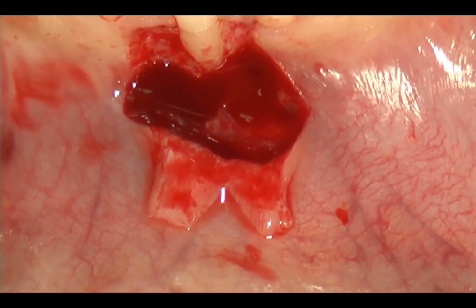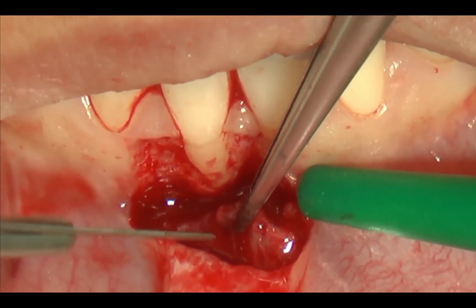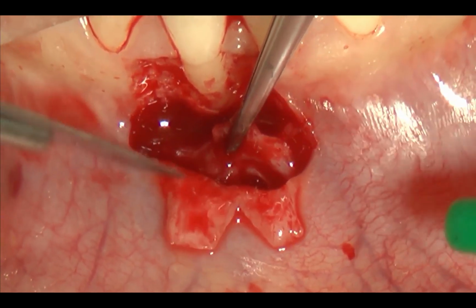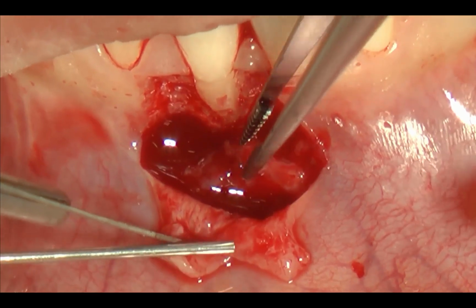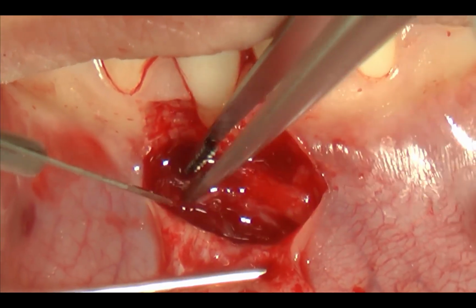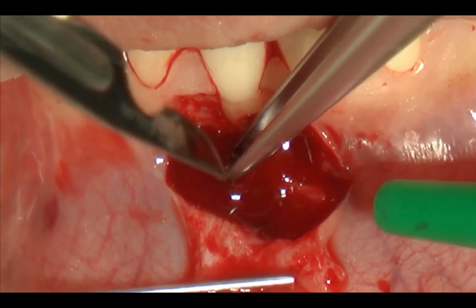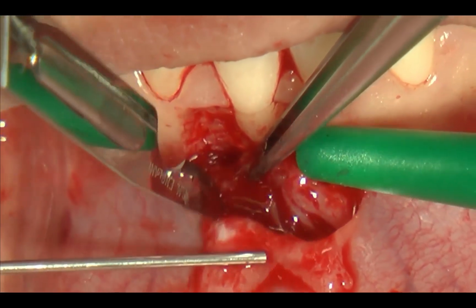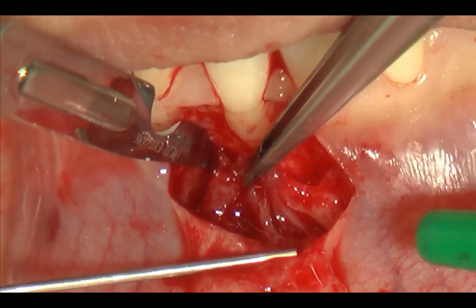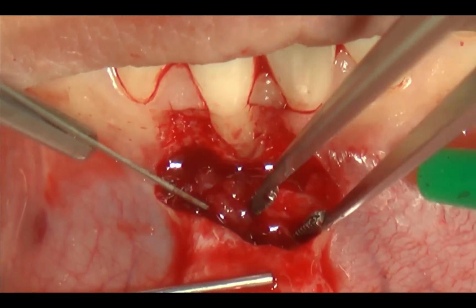So there is one important difference now in the lower jaw, that is the removal of this tissue completely by making an incision perpendicular to the bone, and this is done also at the level of the vertical release incision in order to isolate and remove completely the submucosal tissue.